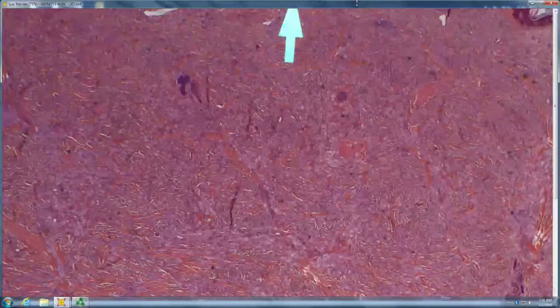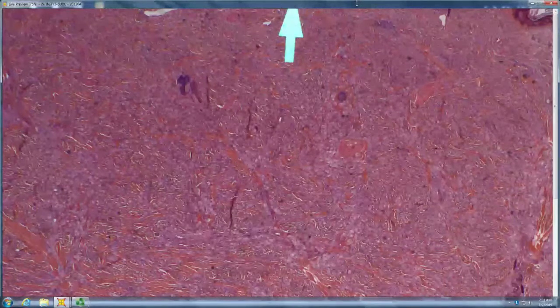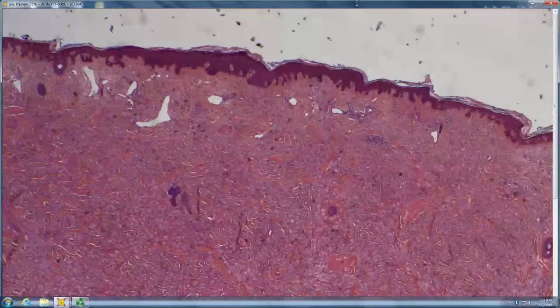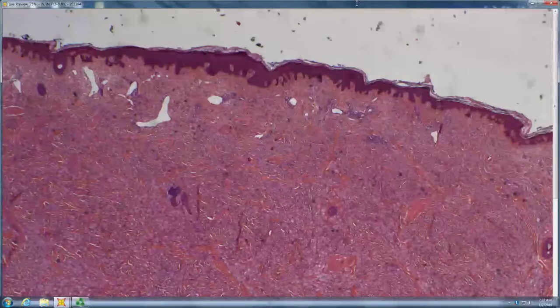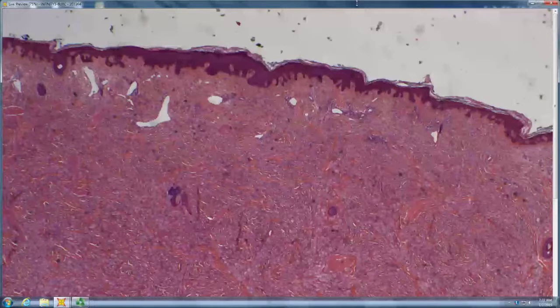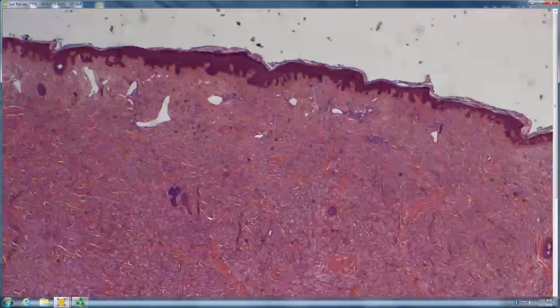So first off, the overlying epidermis, is it attenuated, effaced, or is it acanthotic? Acanthotic. So name a few tumors that produce acanthosis over the tumor rather than effacement. Can you name 3? So dermatofibroma, not DFSP, which effaces, but DF. Dermatofibroma, Spitz nevus, and the third one is in the neural chapter and is GCT, granular cell tumor.